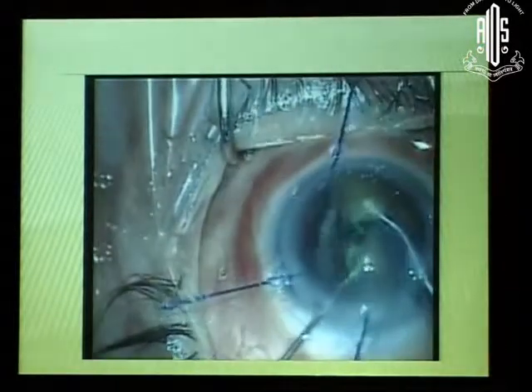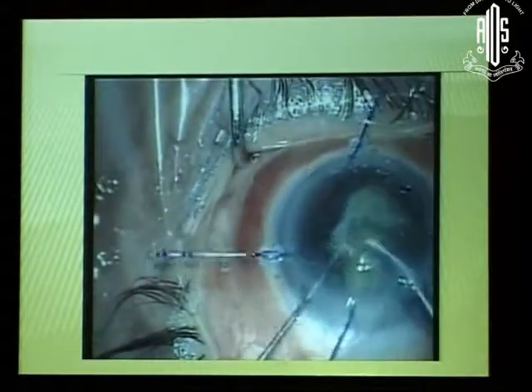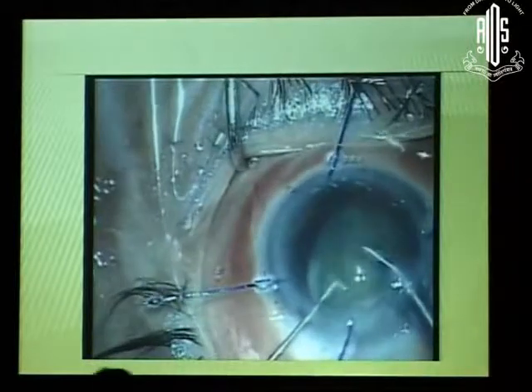This is a hard brown. Split it. It will just hold it. Touch it onto the lens. Gradually put your foot down. It sinks it. It just automatically will sink into place.